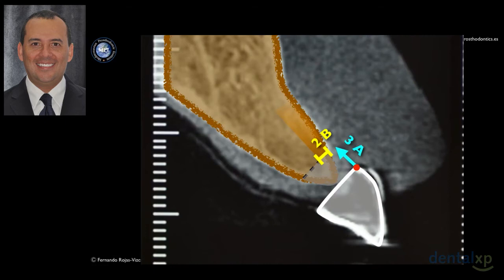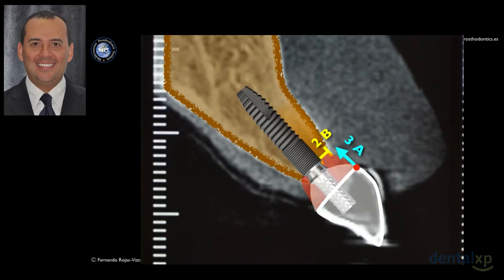So this needs to be the position of my implant. And I can apply here, you can see, the 3A2B rule. If I can place the implant here, I will obtain the space for biologic width where I can screw an abutment, create the ideal profile for the subgingival portion of this crown, and I expect to obtain this situation with this length of clinical crown.